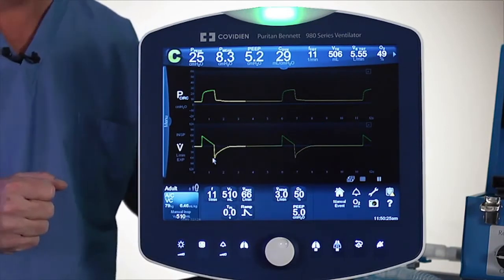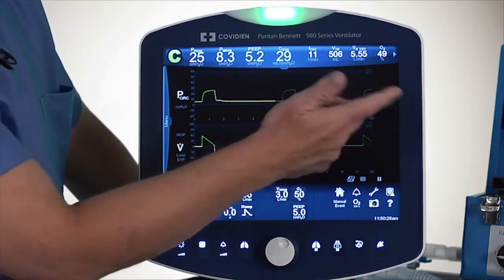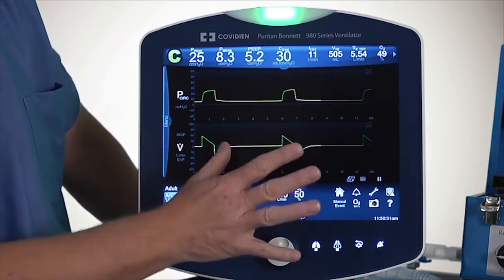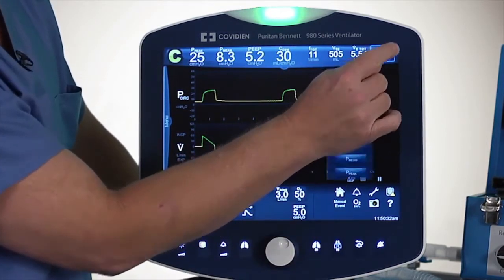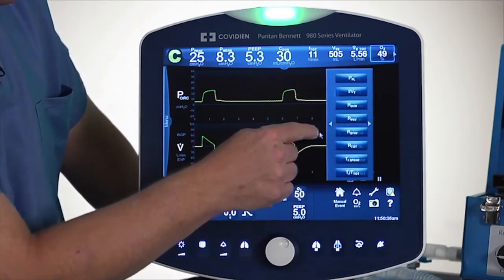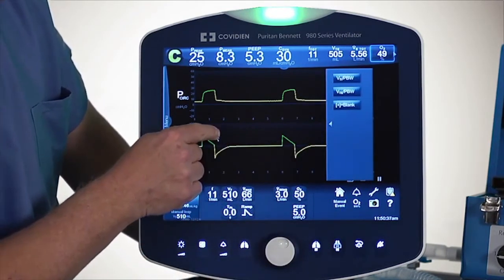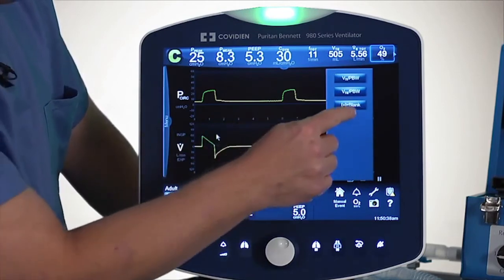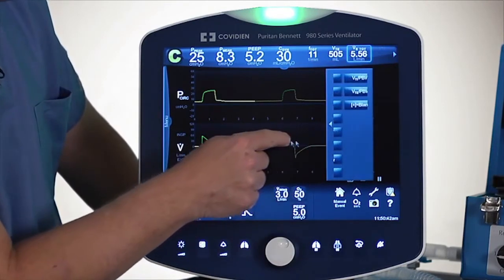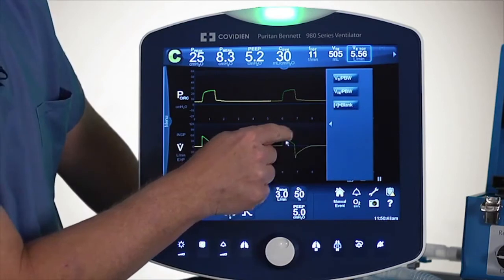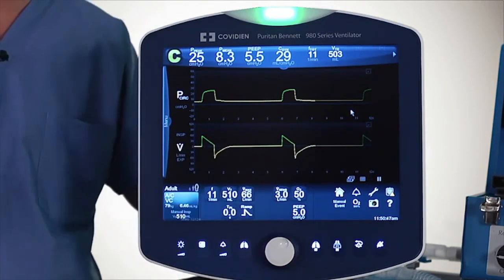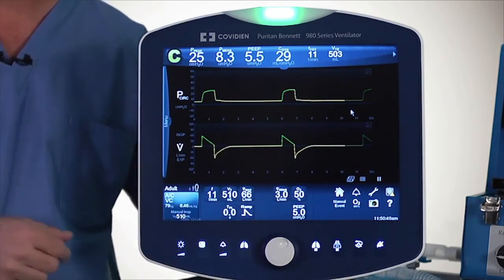In addition to that, you can also come up and say that in certain applications you don't really want to see all this information. So I can actually blank certain cells — I can blank really all the cells if I want. I am going to blank that cell and I am going to blank this cell. You decide how sophisticated or simple you want to make the screen.